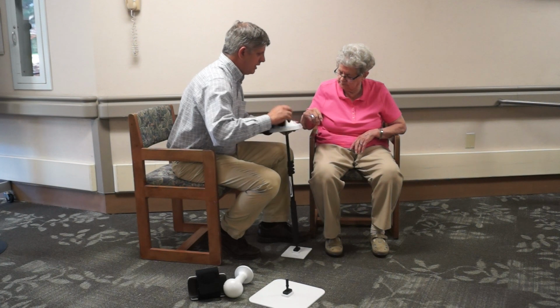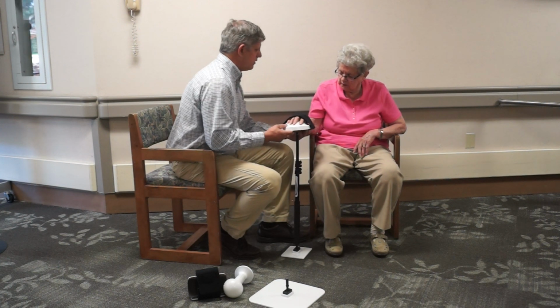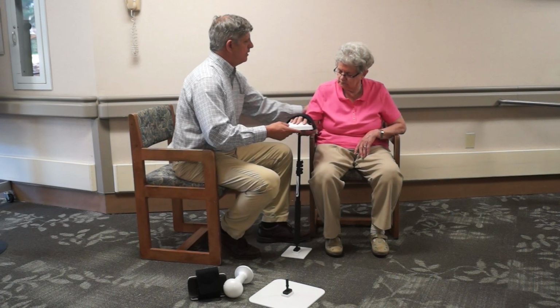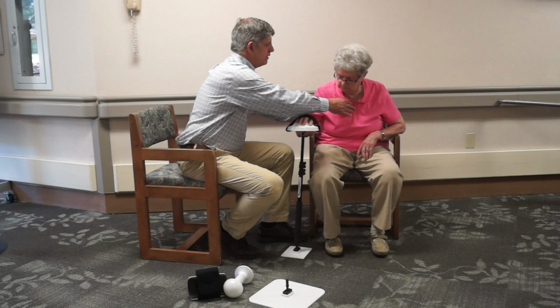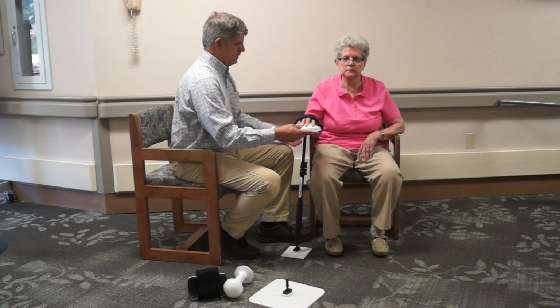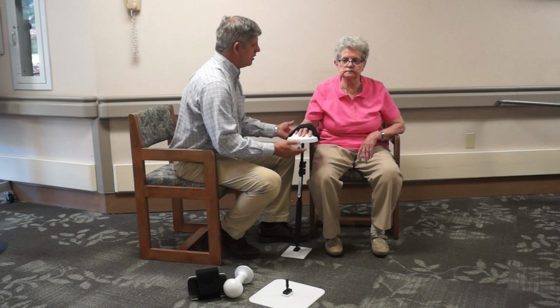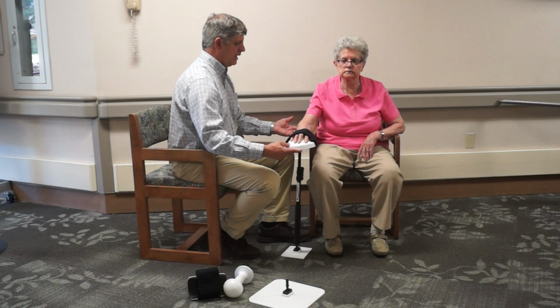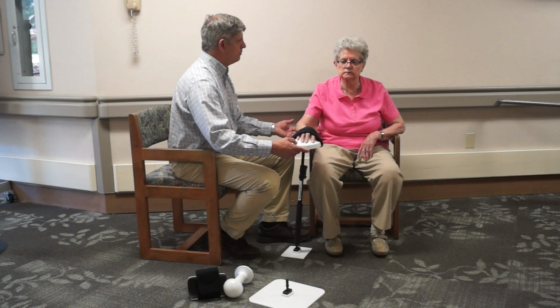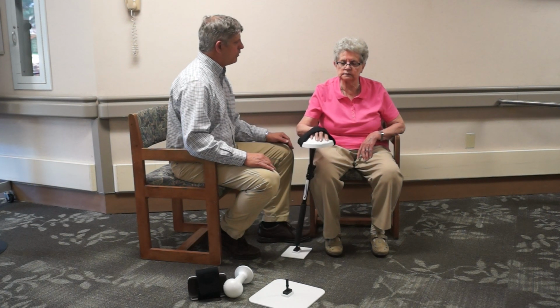So now I'll have you place your hand on top. This will go over the top of you. Okay, now this will just require a little bit more of your shoulders, so stay upright. Bring your spine up tall again. There you go, a little bit taller. There you go. Now that should feel more comfortable as you explore movement. So we'll start low just to begin with. And you're going to find that it's asking more of you, but you have more freedom because of that, okay? So that should feel really smooth now.